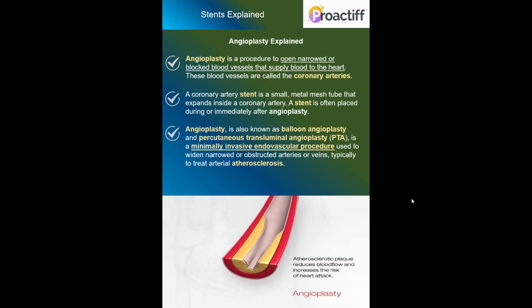Angioplasty. This is a procedure to open the narrowed or blocked blood vessels that supply blood to the heart. These blood vessels are called the coronary arteries, as we have seen earlier as well. The coronary artery stent is a small metal tube that expands inside a coronary artery. Using a balloon type of technique, for example, this stent is put into the artery.